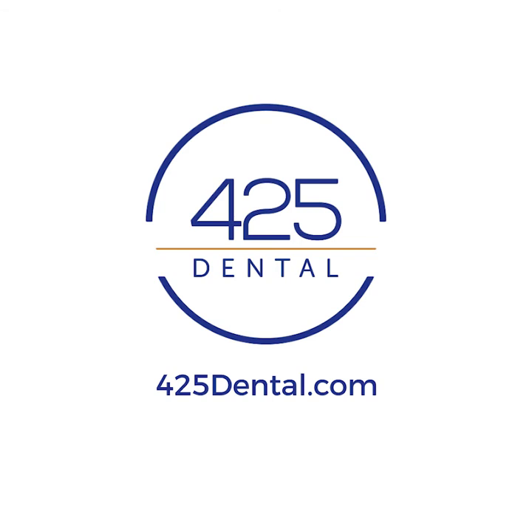We strongly encourage you to wear your aligners during meal times. Leaving them in while eating provides additional wear time and helps keep constant force on your teeth without the back and forth motion of removal and replacement.